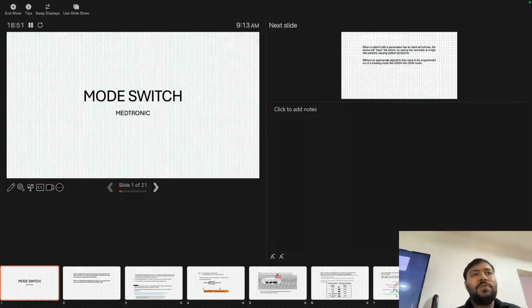And conducted AF response is an algorithm, sir, where it will help you regularize the V to V interval. The ventricle sensor response, obviously VSR, will not help here because it's AF. By using these algorithms, we can increase the BiV percentage a little more, but there is no automatic algorithm to switch to VVI mode permanently if the patient is having a particular number of mode switches? No, sir. Nothing is there.